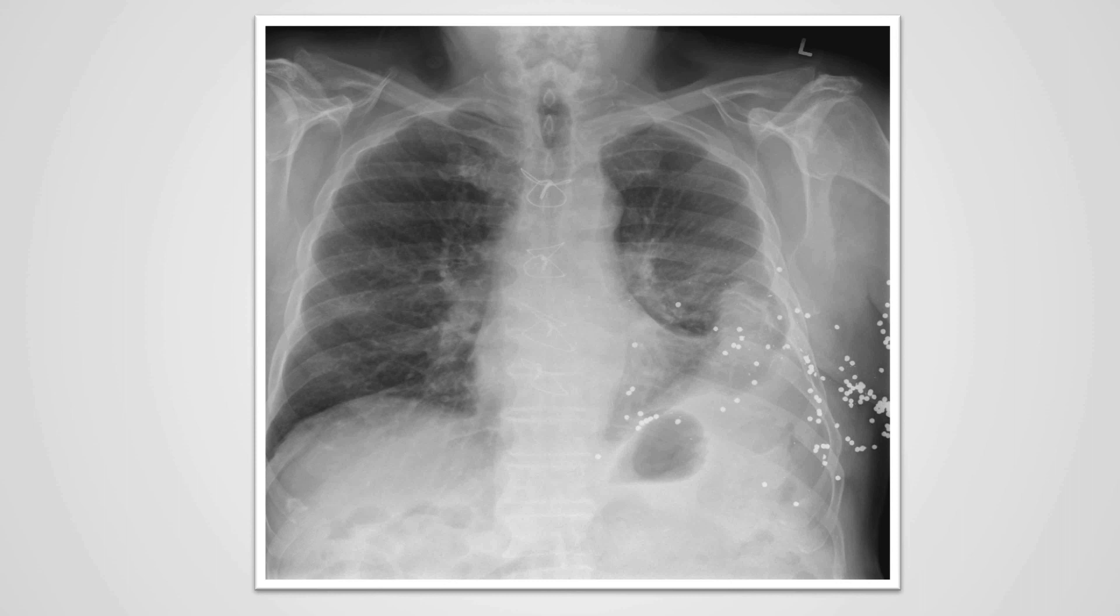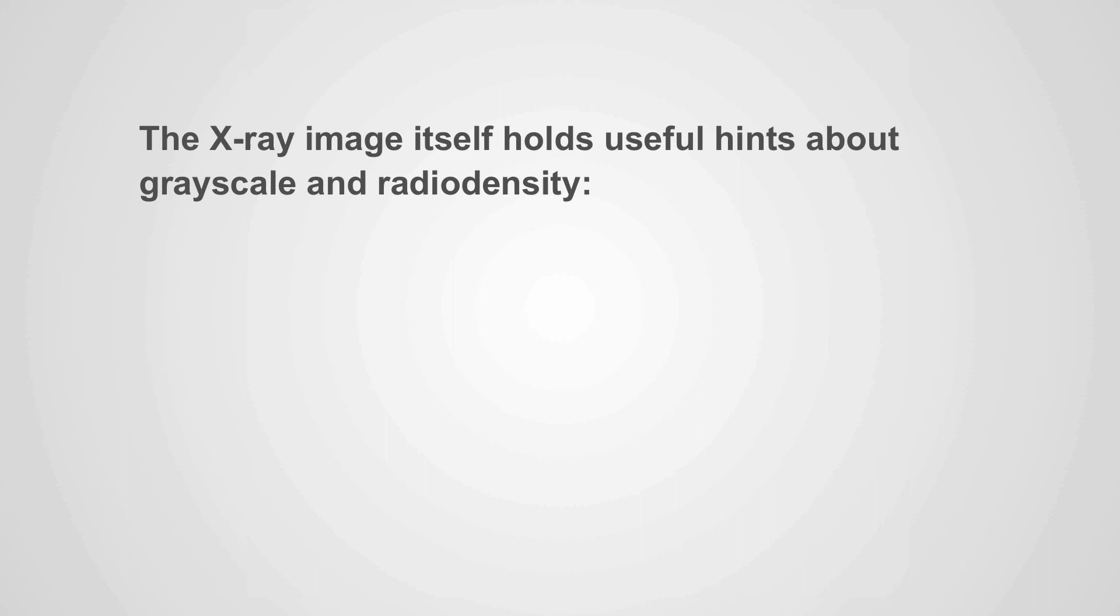In this case here, we have a patient who unfortunately had a mishap while on a hunting trip. And we can identify lead shot within the subcutaneous tissues of the chest wall on the left. In addition to this, we can also identify that there are these white lines in the midline, which represent metallic wires from a previous sternotomy. And we can identify that there are some changes within the left lung and the left pleural space that are secondary to the injury that the patient had from the hunting accident.